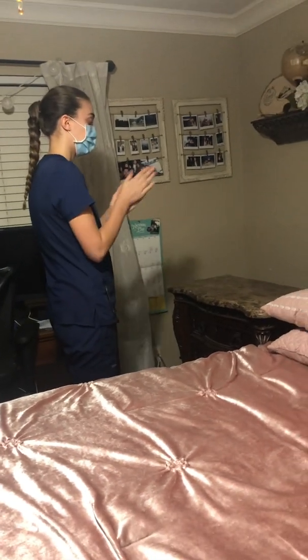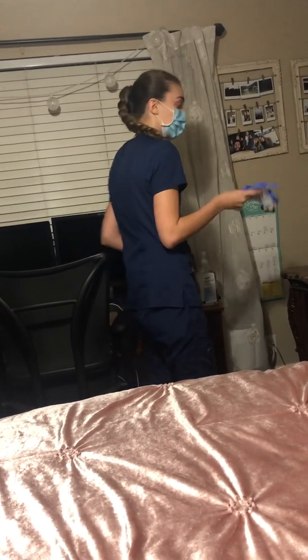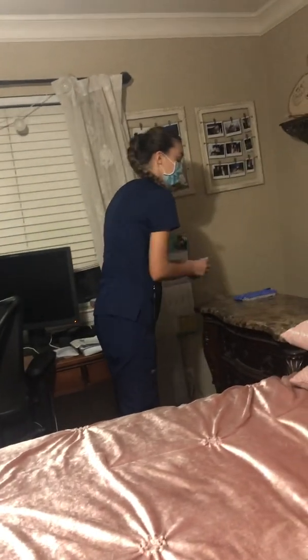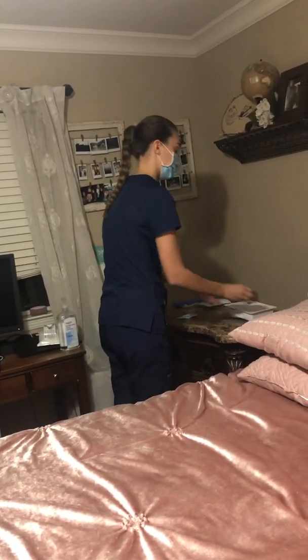Okay. And I want to make sure that I let this table dry for a full 2 minutes before I bring any of my supplies on. So the 2 minutes has passed, so I'm going to go ahead and get my table ready. So I'm going to bring over my clean gloves, my CHG bio patch, my sterile gloves, extra set, and my dressing change tray.